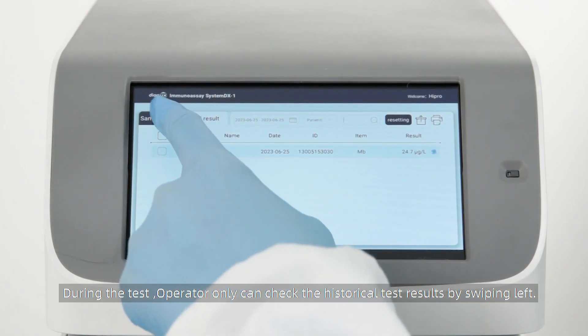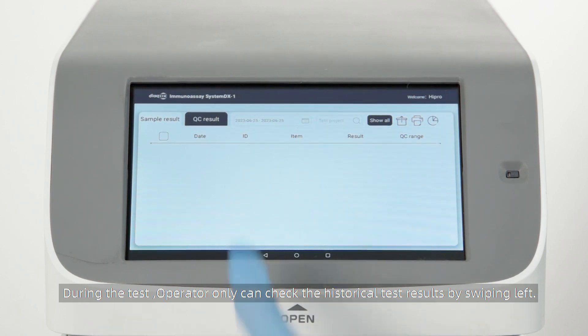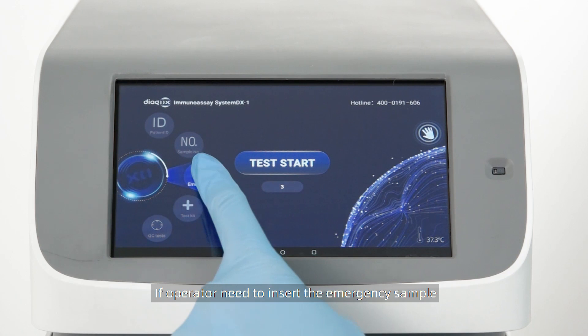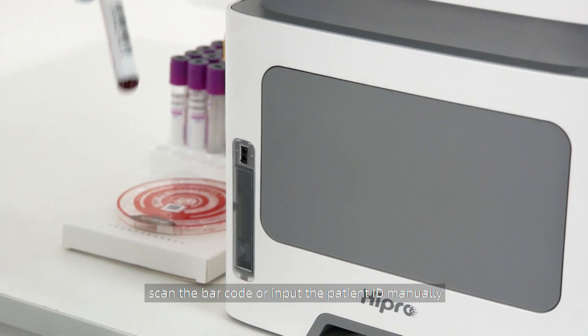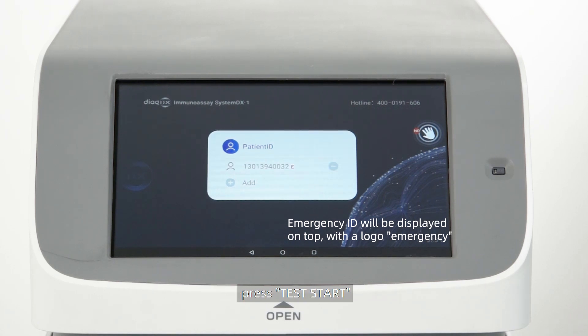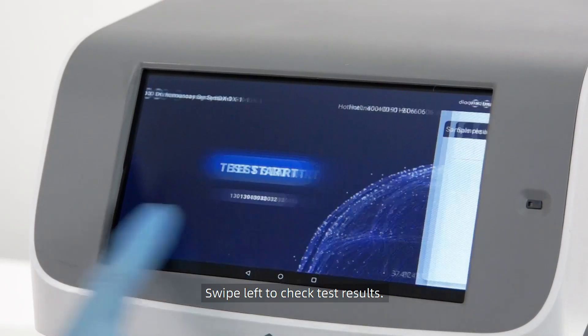During the test, the operator can only check historical test results by swiping left. If the operator needs to insert an emergency sample, press Emergency in the main interface, scan the barcode or input the patient ID manually, press Test Start, then swipe left to check test results.